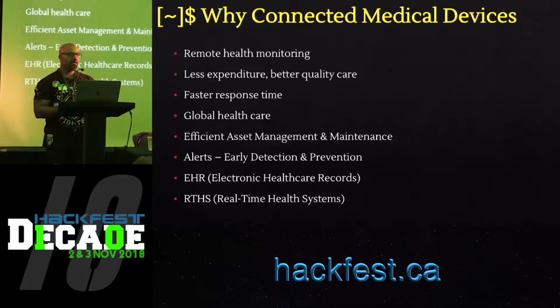We remembered that there's an IRDA port that is exposed, so we took the obvious next step. We went on eBay and bought a PDA. The idea behind buying a PDA was to get it to talk to the infusion pump over IRDA.